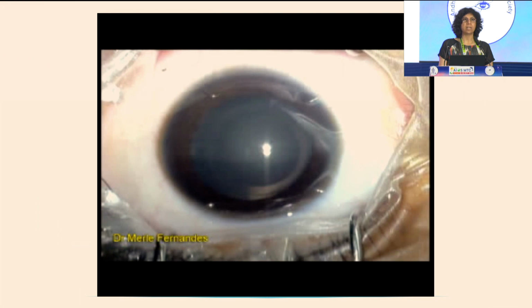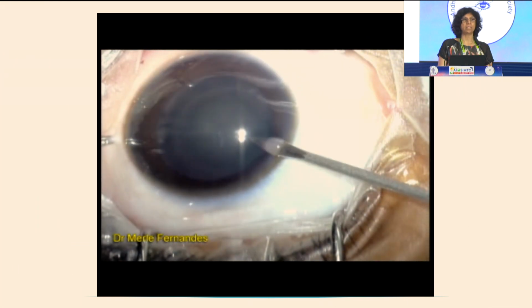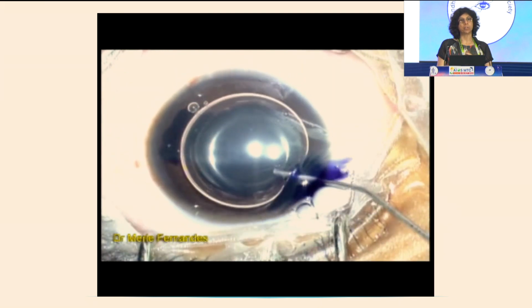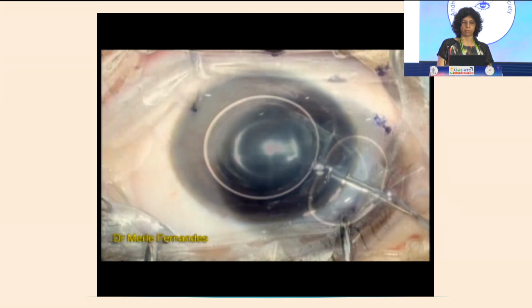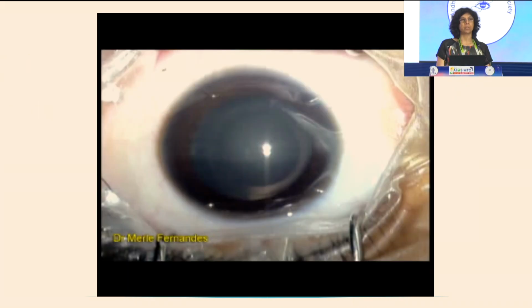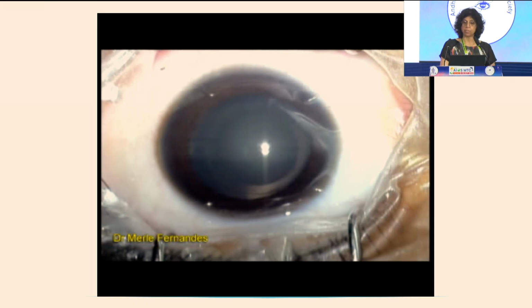So the surgery per se, I'm not going to go through all the details. Dr. Lahani has described it very well in his previous talk. So what we have to understand is that the capsule is very elastic and we need to make sure that the rhexis covers the optic. It should be 5 millimeters and you do it with the help of a rhexis forceps. And the other thing that we have to ensure is that you make a PPC which is a little smaller because you need to have a gap between the anterior capsule and the posterior capsule enough to accommodate the intraocular lens. When you're putting it inside, it doesn't fall into the vitreous cavity. And we always land up suturing. So I'm not going to cover anything about the surgery per se.